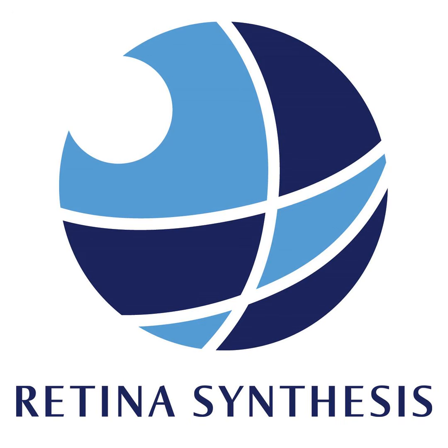And it's so much easier to quantify these areas relative to the other reflectivity in the background of the OCT B scan. So he's come up with this algorithm that actually allows us to quantify the pigment burden, the hyperpigmentation burden in the back of the eye. And he's developed it both for swept source OCT and spectral domain OCT. And we've been applying it, and it's a very powerful technique because now you can not only quantify the hyperpigmentation burden, which allows you to assess the risk, but you can use this OCT coefficient imaging strategy to almost image any layer in the back of the eye. You just have to adjust what level of optical attenuation coefficient reflectivity you're going to identify.